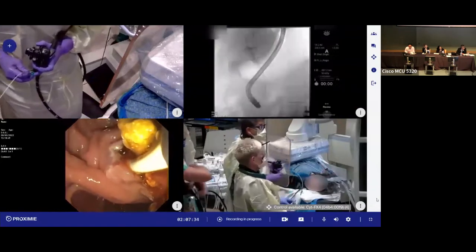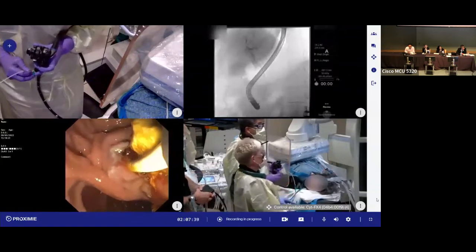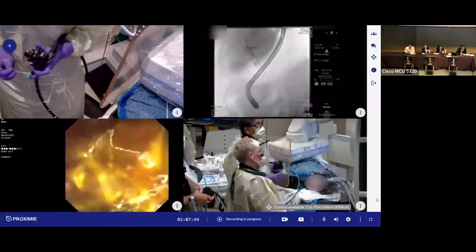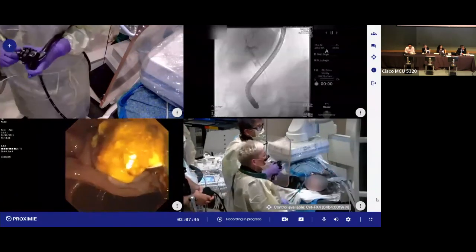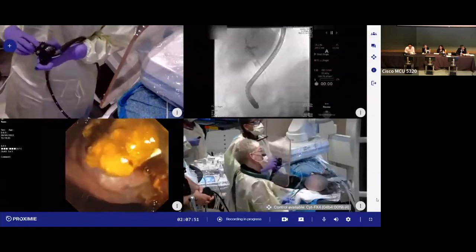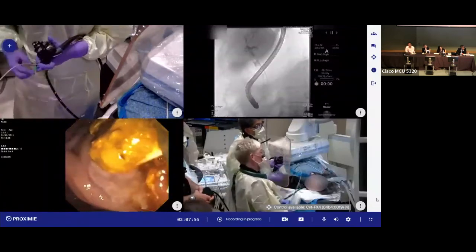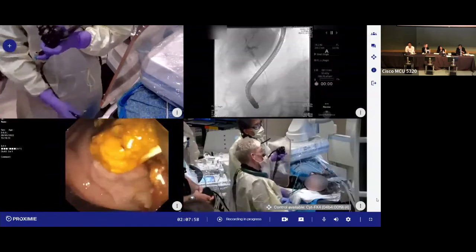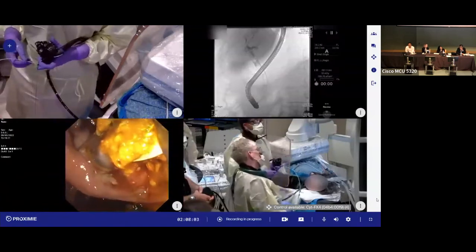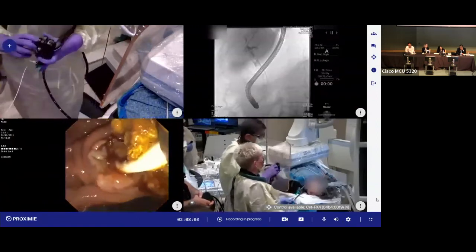And as far as cannulation technique, I tend to try to engage our nurses and techs as much as possible. And I also think it's helpful because every once in a while, you have a difficult position and the tome is in a funny position, the duodenoscope's in a funny position, and you really need to rely on your nurse and expertise to maneuver a wire, manipulate a wire where you want it to go. So I tend to begin cannulation with the assistant doing the probing of the wire, and then after maybe a couple minutes or so, if it looks difficult or if I anticipate it's going to be very difficult, then I'll do physician assisted thereafter.